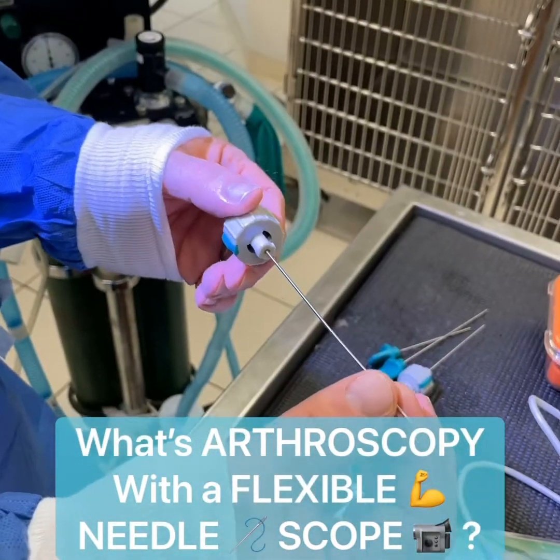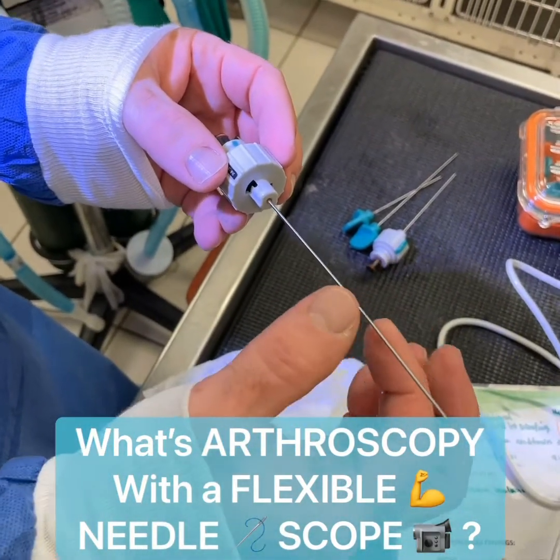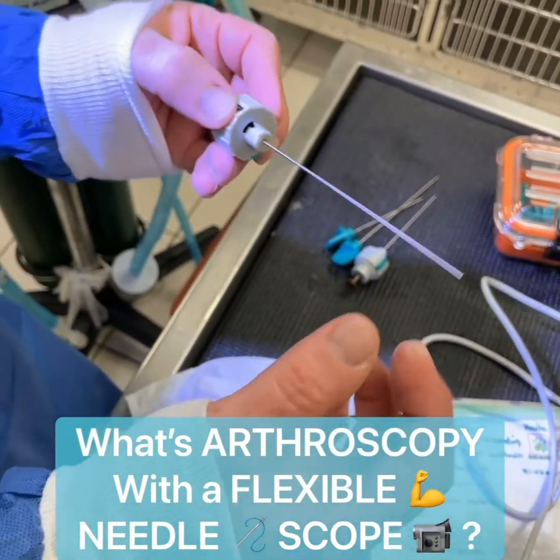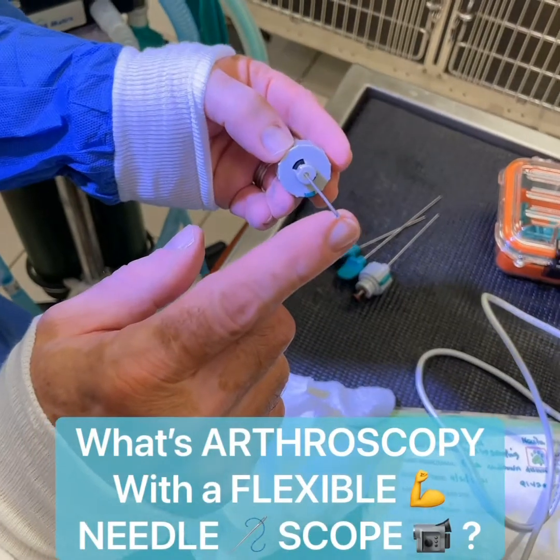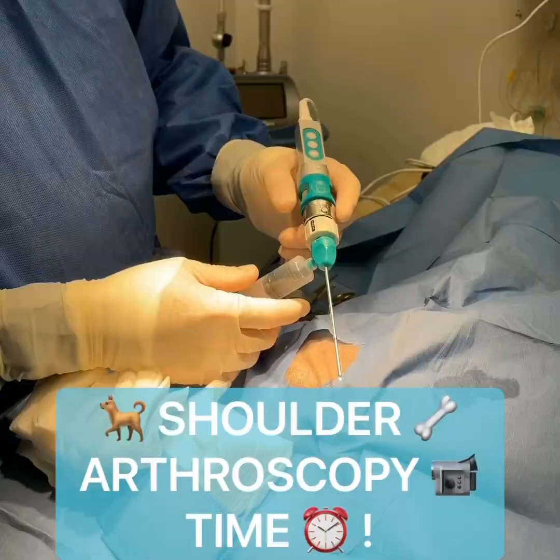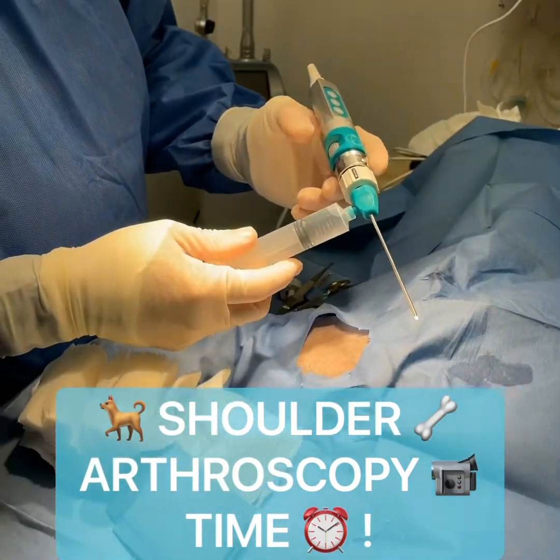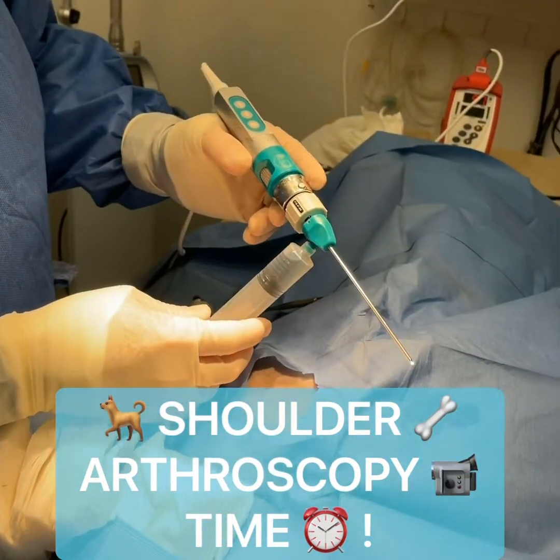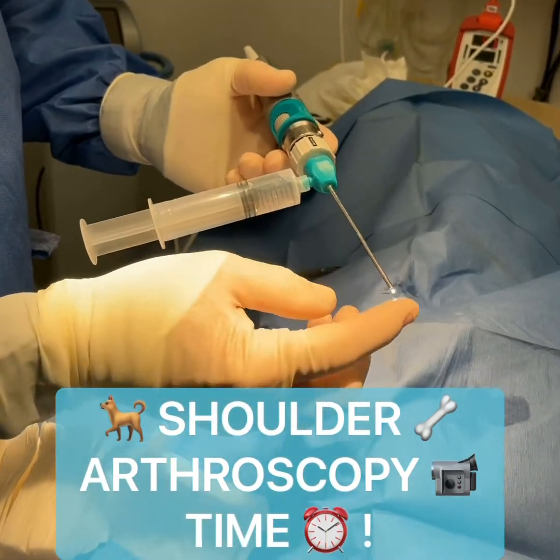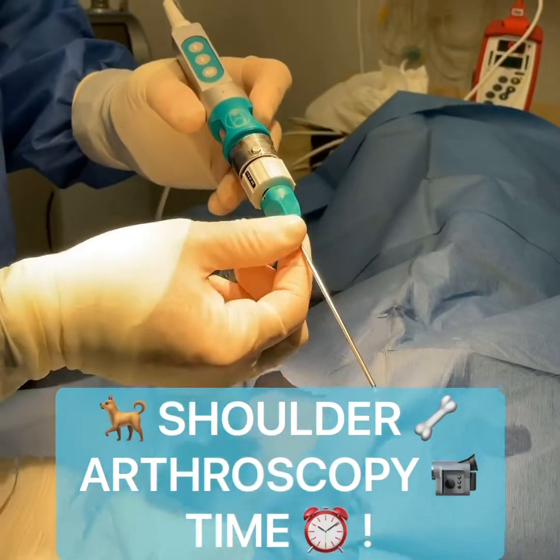One of the great things that I love about the needle scopes is that traditional arthroscopy is very rigid and those cameras would break. This is actually a very flexible scope, and apart from that, it's only 1.2 mm, so it's truly just like injecting a needle into the joint. Today we're going to be doing the arthroscopy, or needle scoping, with this BioVision needle scope — a 1.2 mm needle with a camera. We can take video and pictures, we can focus. It's the smallest scope on the market.